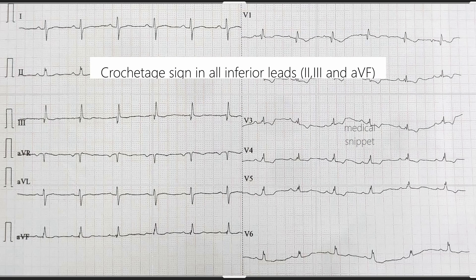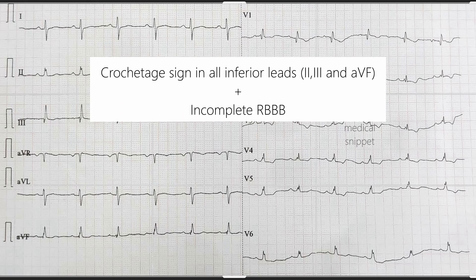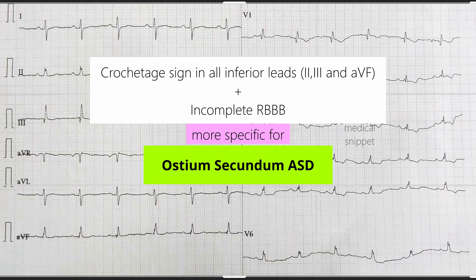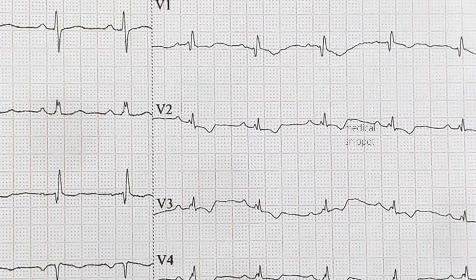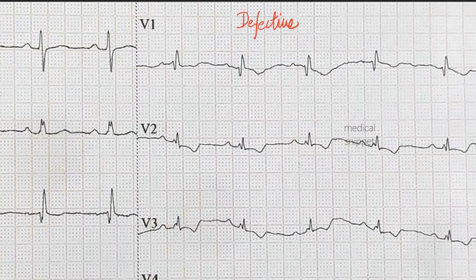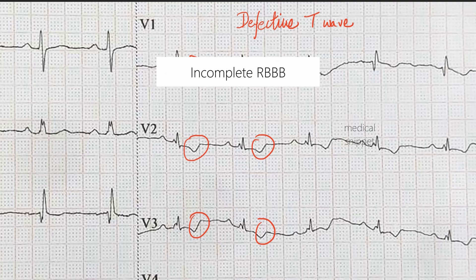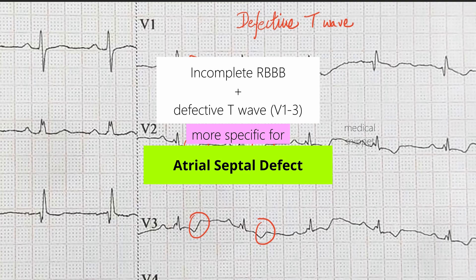If Crochetage sign is present in all three inferior leads — that is leads 2, 3 and AVF — along with incomplete right bundle branch block, it is more specific for the diagnosis of atrial septal defect. It should be noted that incomplete right bundle branch block without any other ECG changes may be a normal finding in children. Hence incomplete right bundle branch block alone is inadequate to diagnose ASD. In ASD there is also a defective T wave pattern, seen as inverted or horizontal displacement of the proximal T wave in the right precordial leads V1 to V3. Incomplete right bundle branch block along with the presence of defective T wave in V1 to V3 is also more specific to diagnose atrial septal defect.